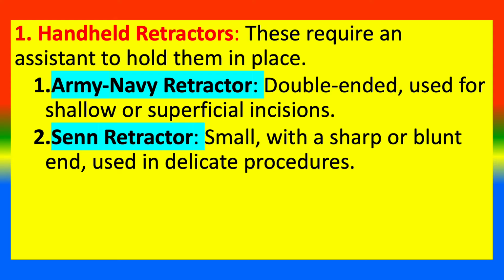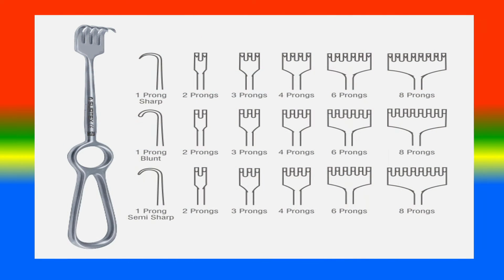Second, Senn retractor, small with a sharp or blunt end, used in delicate procedures. Look at these different types of retractors.